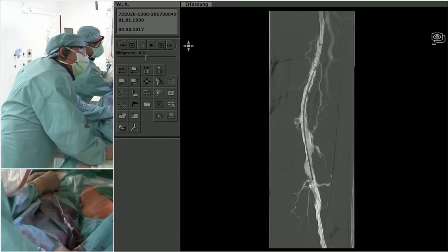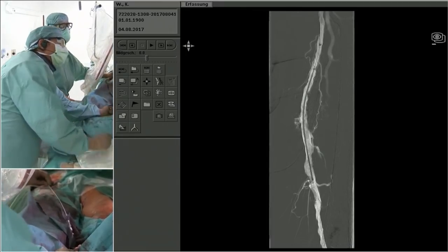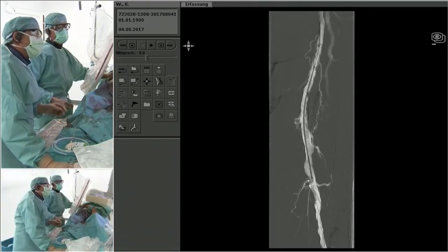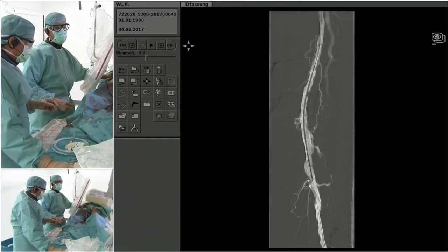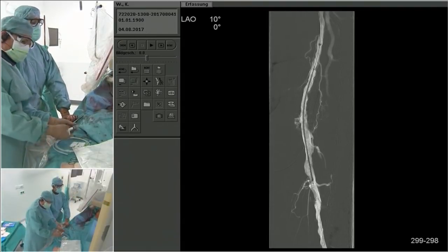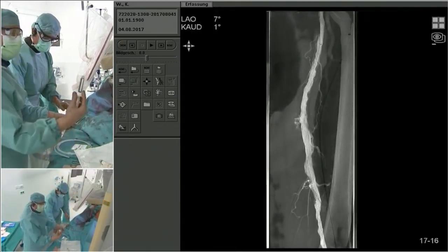Okay, I think this here is a good idea. Between these two collaterals, what do you think? Okay. Does the panel agree on the location? We have a closer look to the distal one. I go with that area actually. I agree too. Yeah.